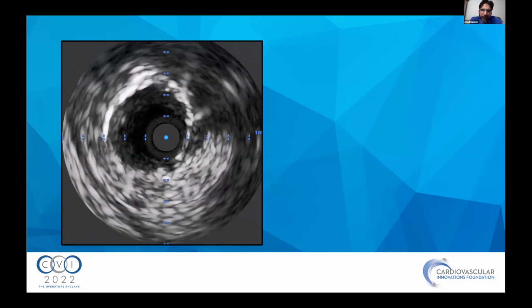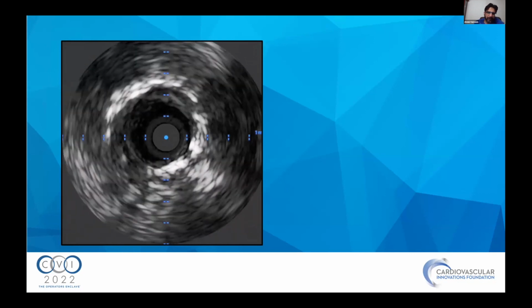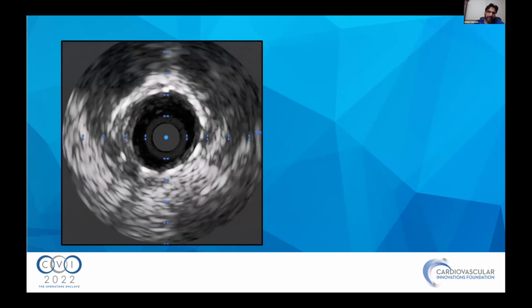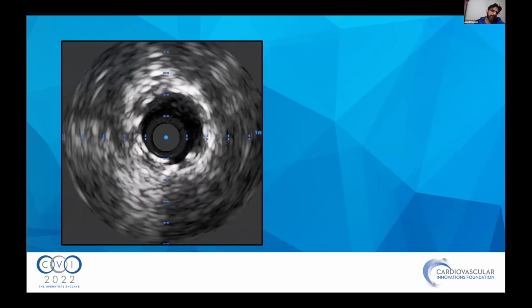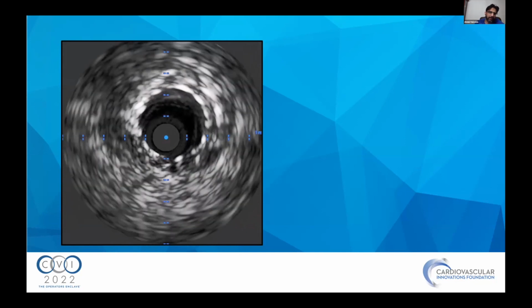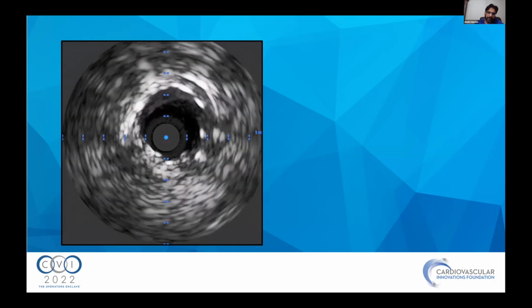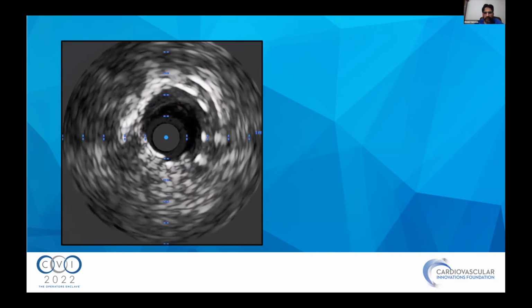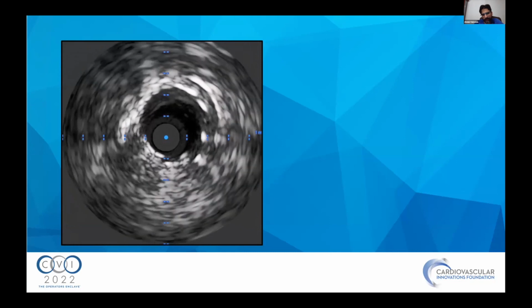Yeah, I think this patient should have gone to CABG up front. This is a young guy, as we know. ISR in about a third of cases is not clinically silent and presents as an ACS. So the stents failed. Yes, there was a mechanical cause for it, as is often the case in patients in shock. We often tend to undersize stents because time is of the essence, and we don't image and do things the way we're supposed to. But he had stent failure in less than a year, so maybe sending him to surgery up front would have been one option.